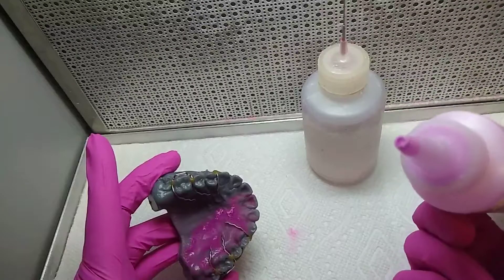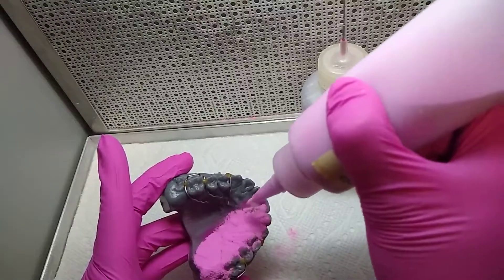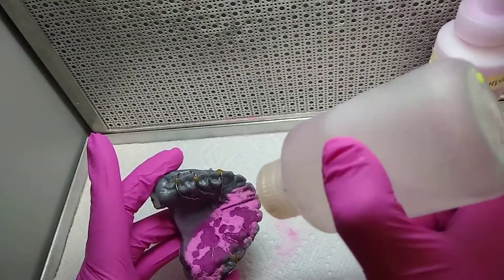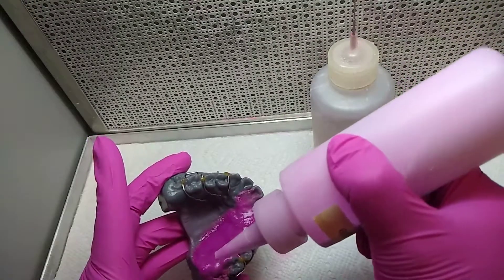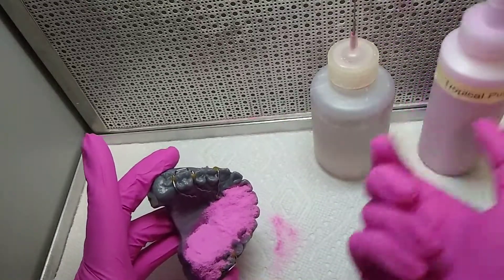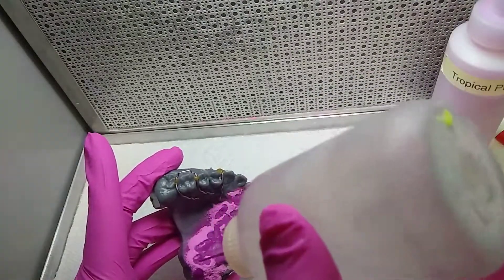Let all the polymer get wet with your monomer, and never pour more than one millimeter thickness of acrylic at a time. If you put too much monomer, the acrylic will shrink a lot, so you have to put just enough to wet the polymer.